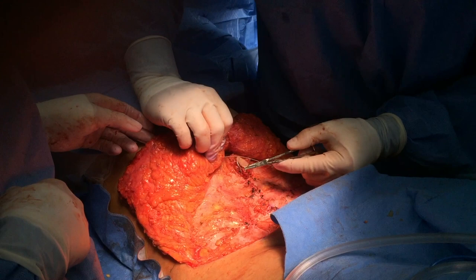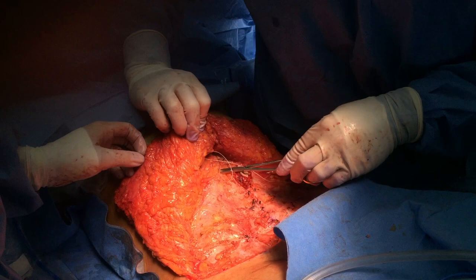I can see that I can place it just lateral to the umbilicus. Here I'm grabbing a nice big bite of the anterior rectus sheath, and we're going to tag this one and go ahead and trim it and then place the next row.